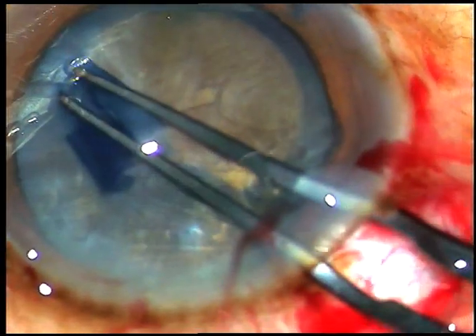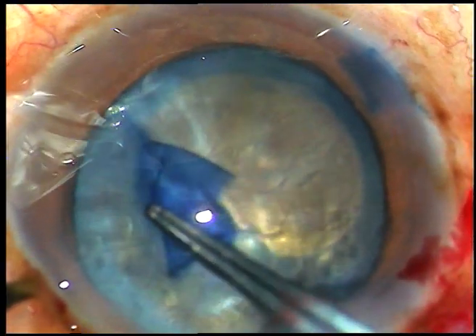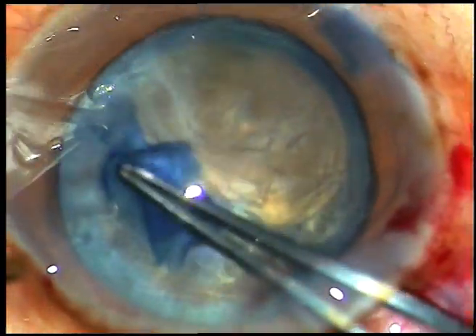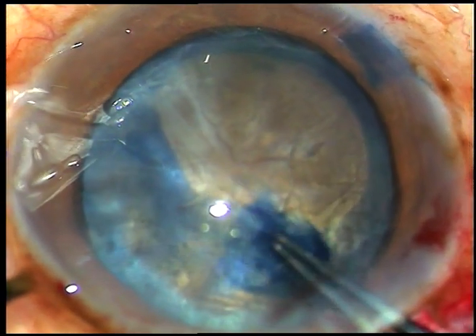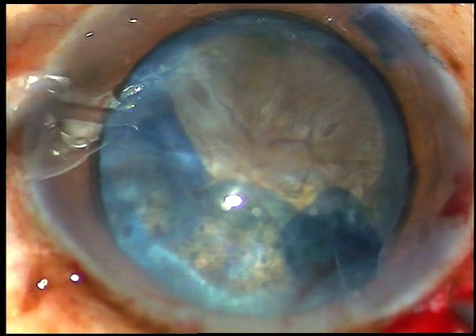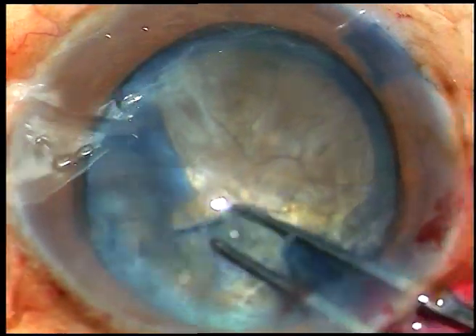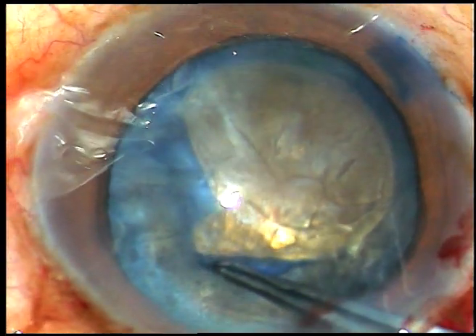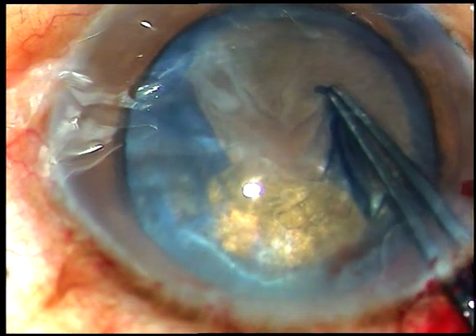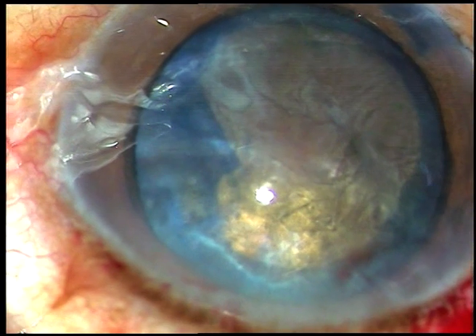There is a fibrous band and the capsule is stuck there. I tried to pull it centrally and then wanted to go peripherally but it didn't happen. So what has happened is, you can see there is a radial tear here. I hold it and complete the rhexis of this part, then inject some more viscoelastic substance.